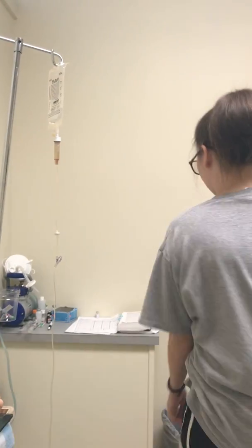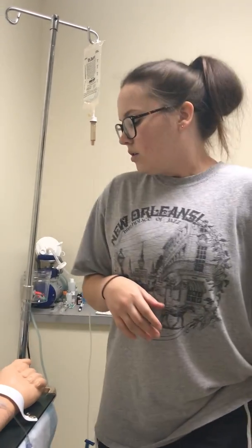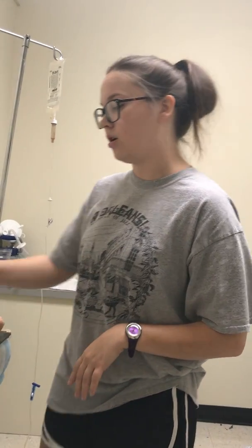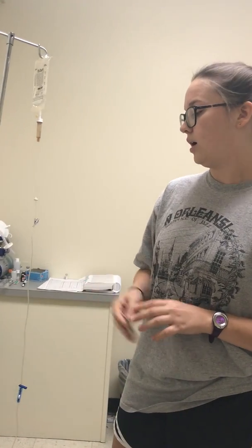Discard in the trash. And I would lower the bed, side rails up, make sure that, again, he remembers not to get up, make sure his call bell is near so that he can use it if he needs anything, and then I would document.